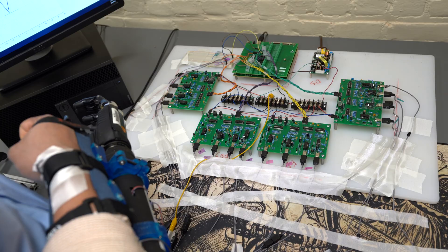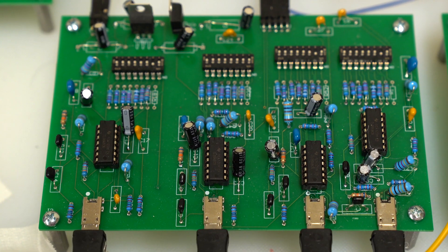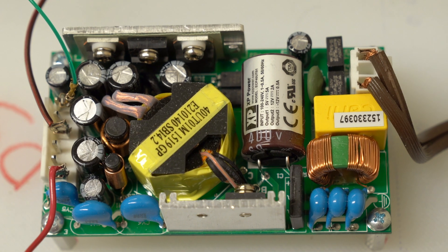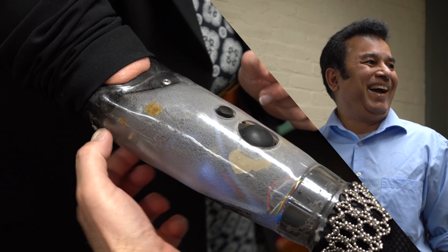We've been working for about four or five years with Liberating Technologies — work done both at their facility and here at WPI — putting the best aspects of what we can contribute to the project to make devices that are better for prosthesis users.